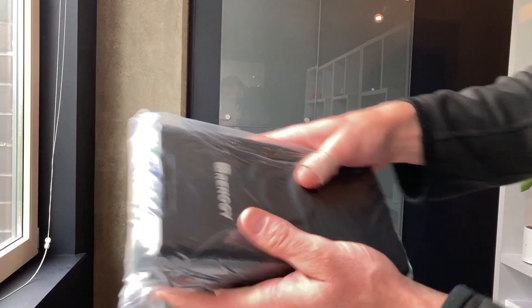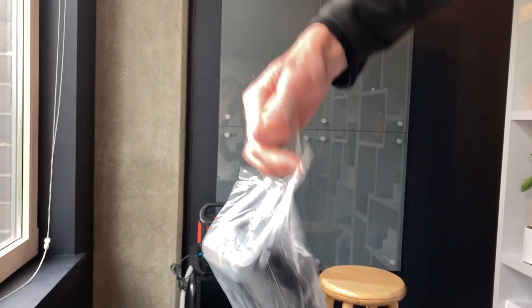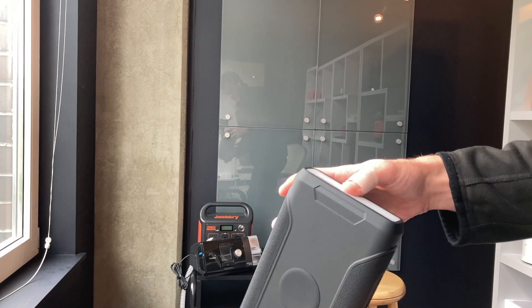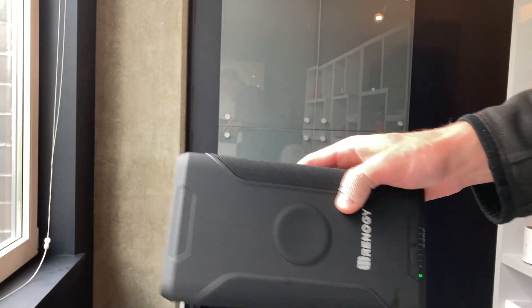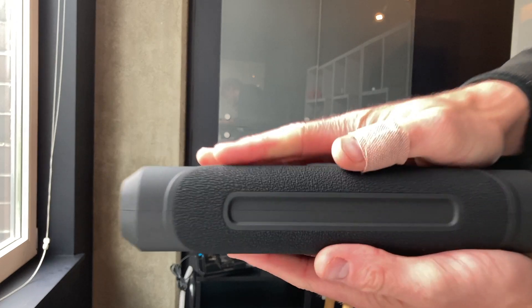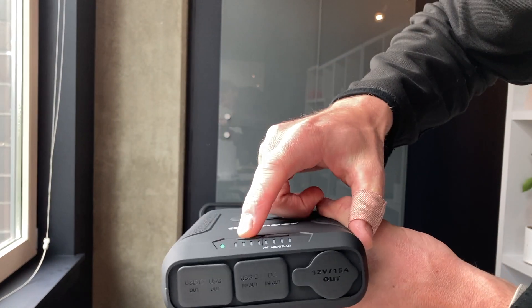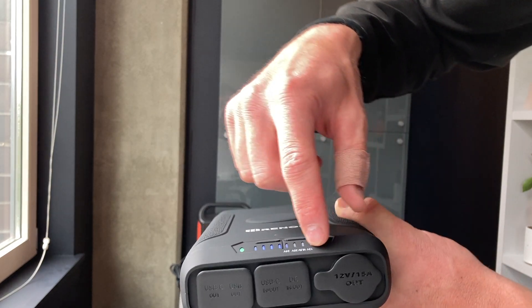You can kind of see the size here. It's definitely not light, but I like the feel of this quite a bit. Just to give you a size comparison, here's a normal can. It's nice and not too thick, which I like. So we can do 24-volt, 20-volt, 12-volt output.